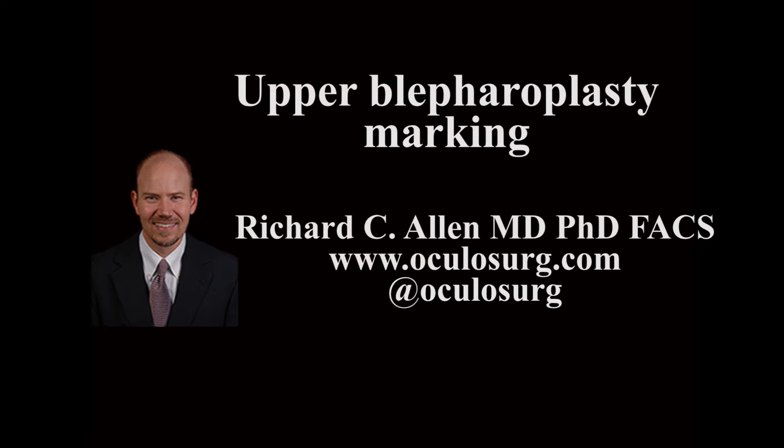This is Richard Allen at Oculusurge.com. This video demonstrates one of many techniques in the marking of an upper blepharoplasty. The skin is cleaned with an alcohol swab and a fine tip marker is used.